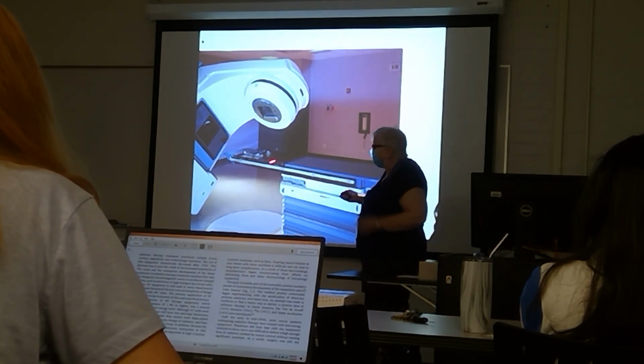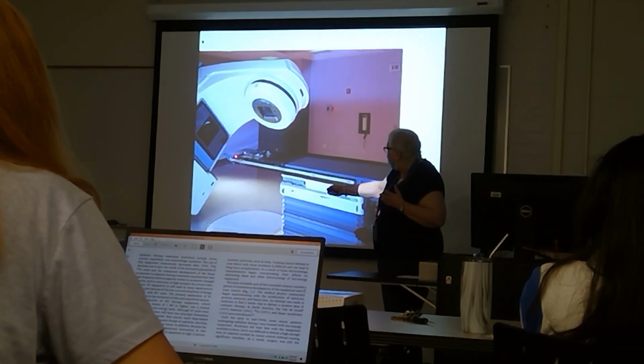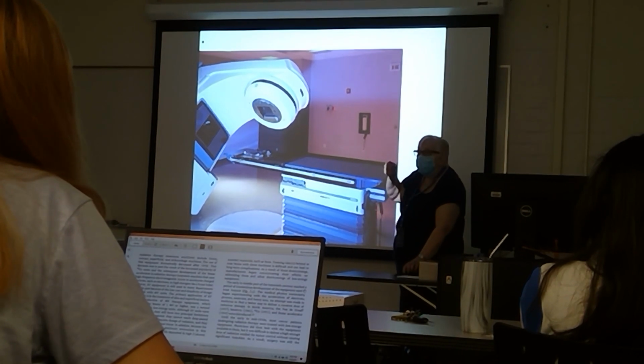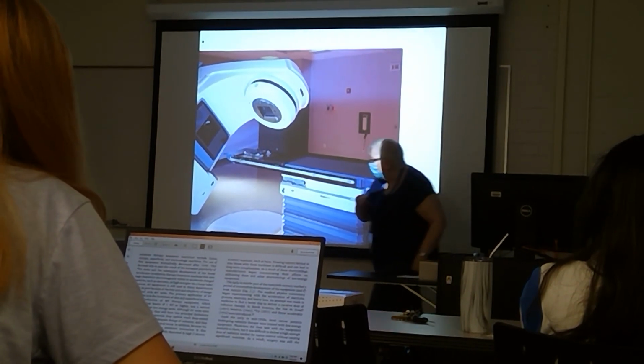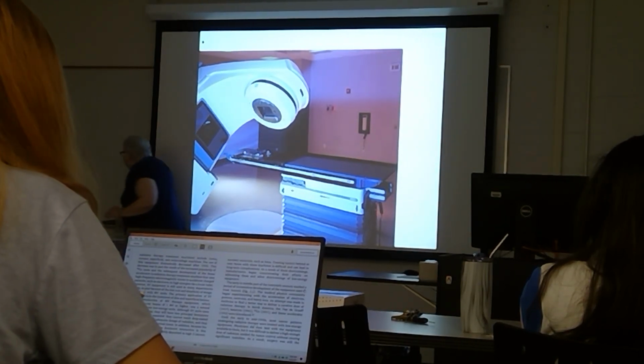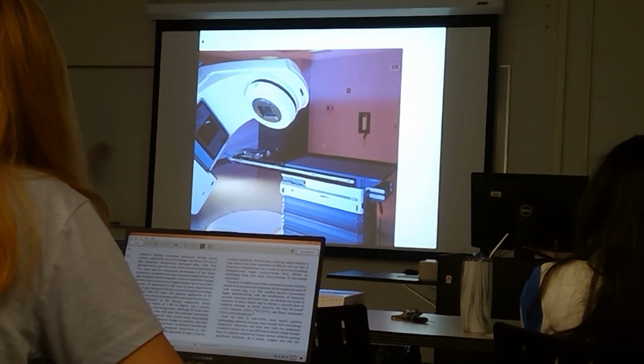This is what I was talking about. So the top of this bed from here to here would be removable and it can be turned around. And you'd have, so this would be the top of that bed.